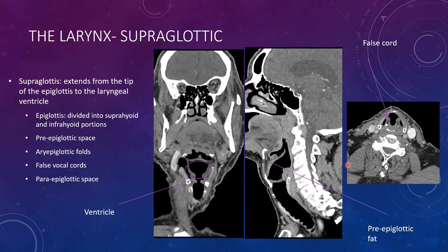The supraglottic larynx is from the tip of the epiglottis to the laryngeal ventricle, which is this space right here. I like the coronal view because it looks like a goblet — you have the false cords, the ventricle, and the true cords. Everything from the false cords up to the epiglottis is the supraglottic larynx. You want to make sure there's no infiltration of that preepiglottic fat. Where the epiglottis attaches is called the petiole. On axial view, you're looking for fat density — the false cords are fatty.